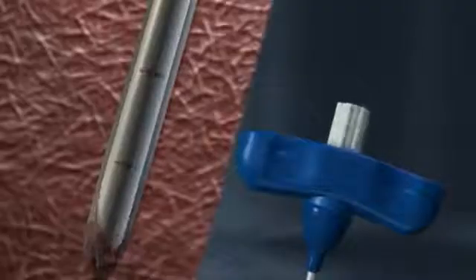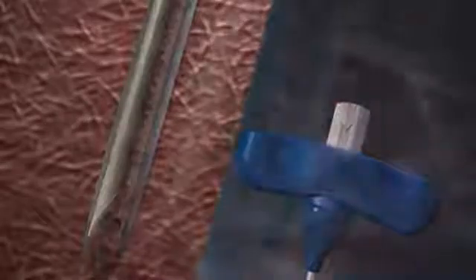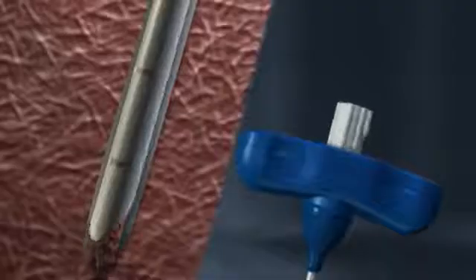Notice that the marrow acquisition cradle rotates, not the needle. The only turning that takes place is on the inside of the cannula. There's no need to twist or oscillate the needle in order to separate the specimen from the cavity, so there's less chance of irritating the sensitive periosteum. There's also a reduced chance of altering the architecture of the sample.